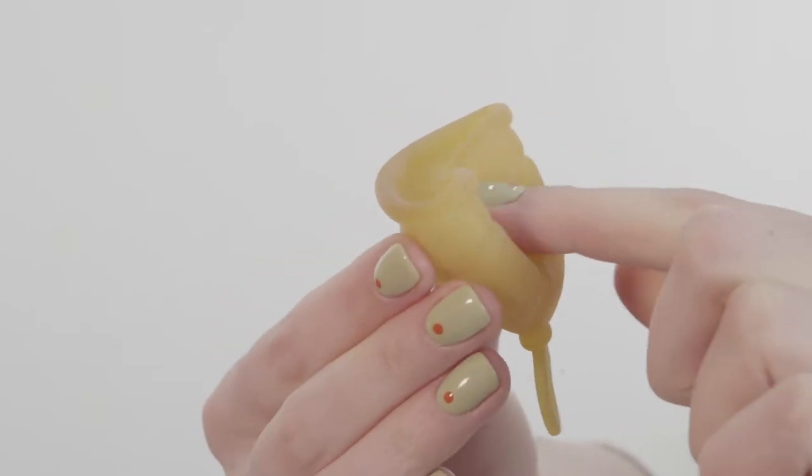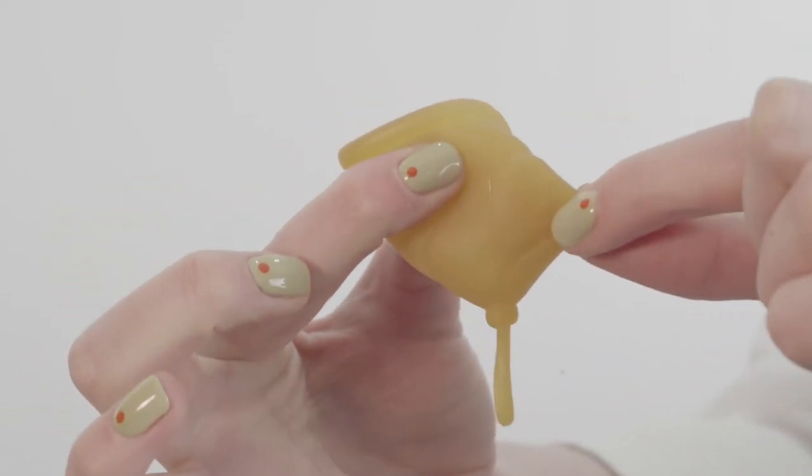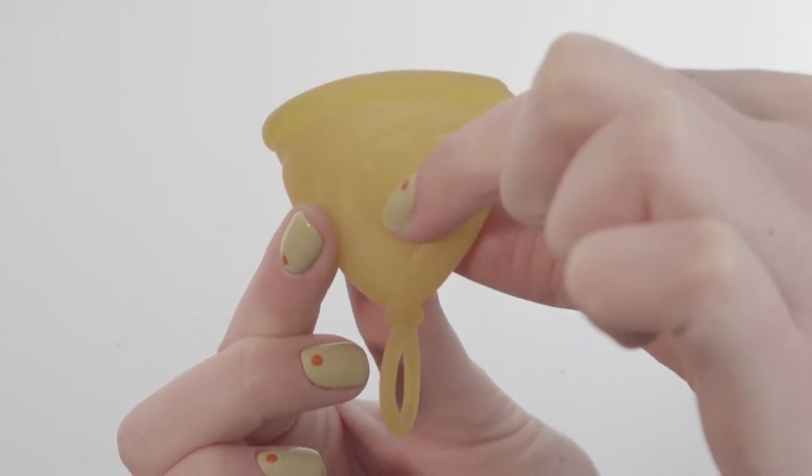The one I recommend the most is the Punch Down Fold, where you just locate the little tip of the cup here and fold the cup down in on itself. It's got a nice small entryway, and it's really easy to insert and nice and easy to pop open once you've done so.